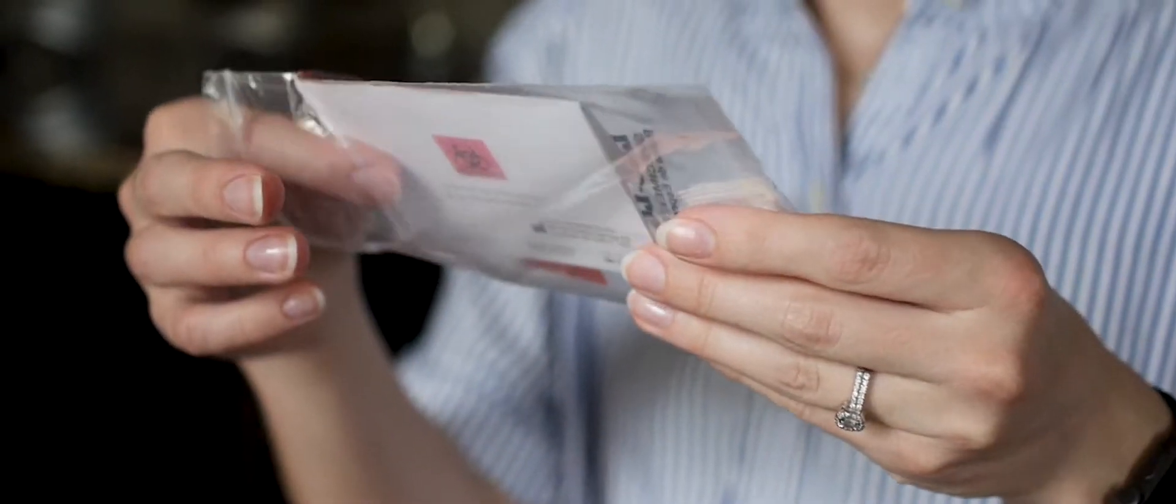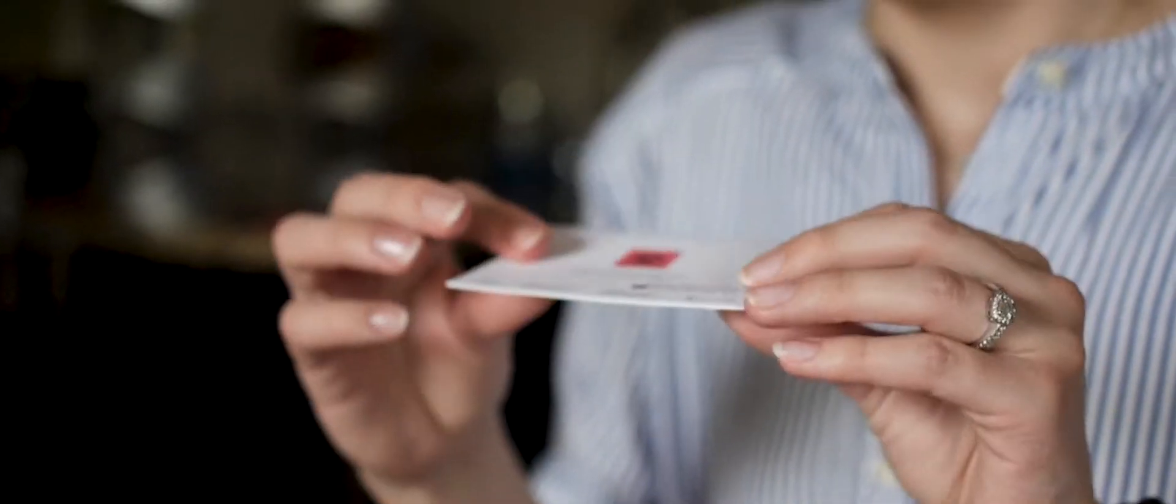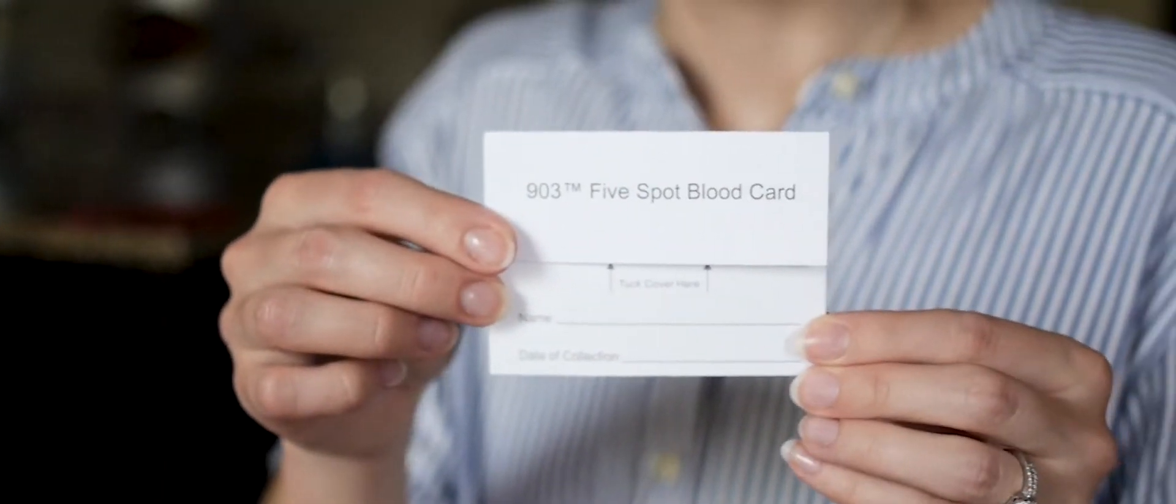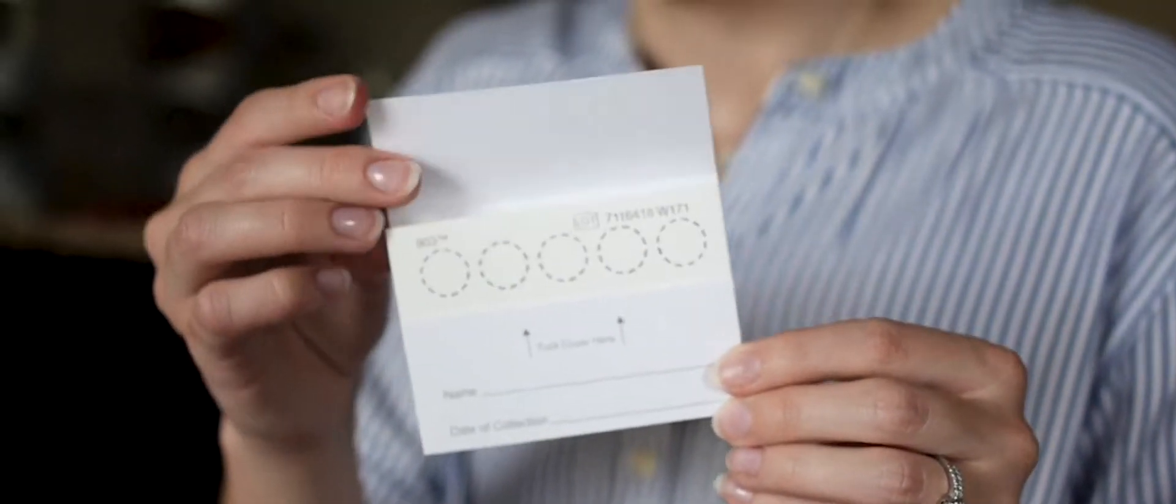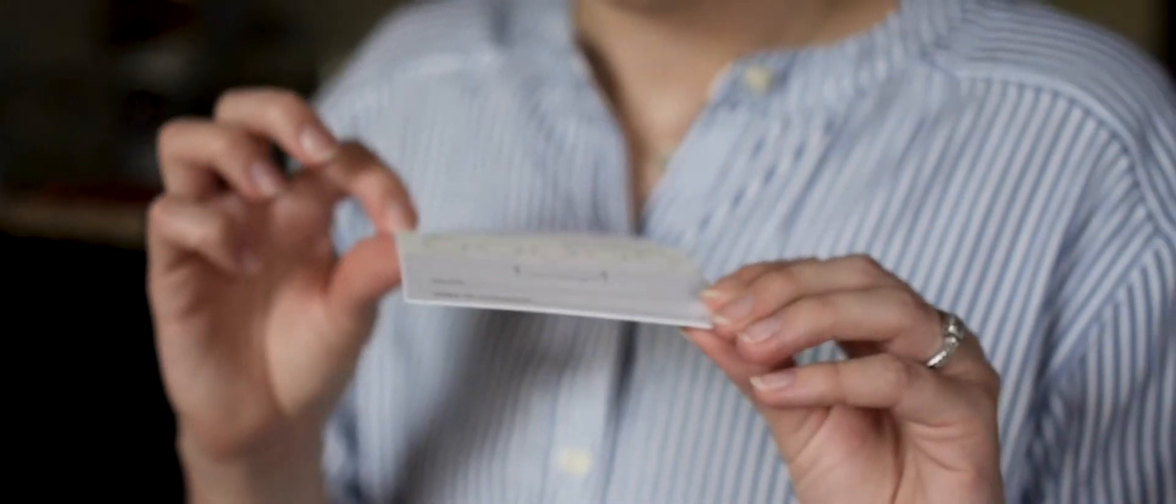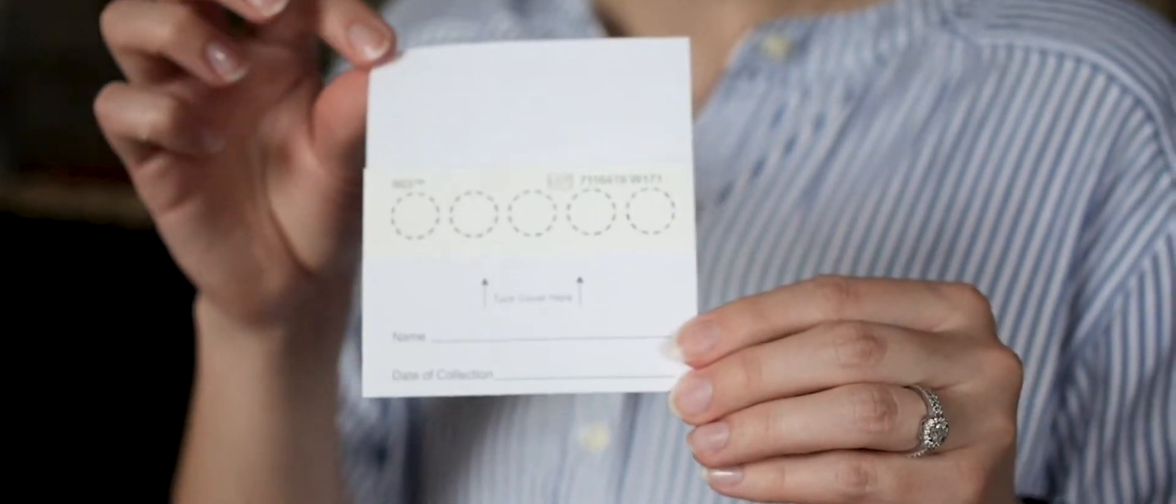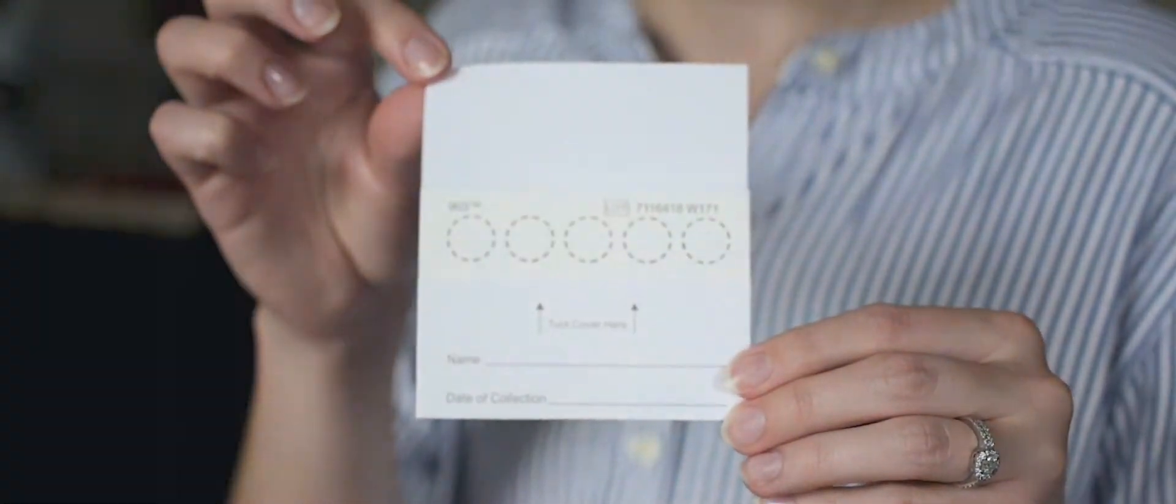On the dry spot blood card, clearly write your name and date of collection. Additionally, clearly fill out the requisition form and sign it. Any missing information may delay your results.